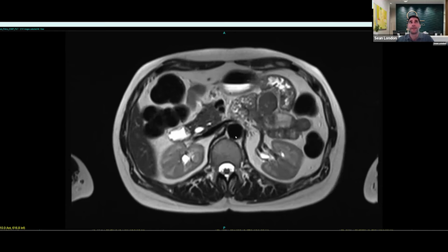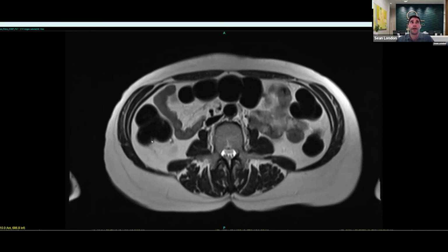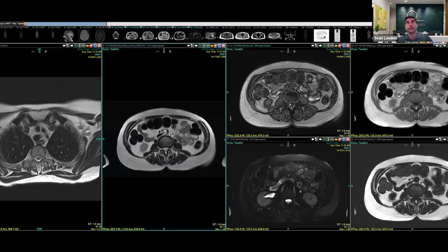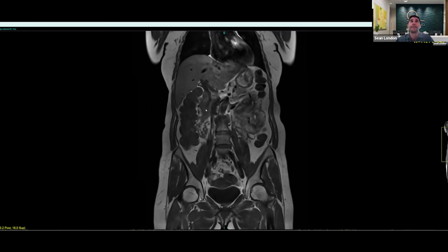The next thing I do is I look at the bowel, so the colon. That's right over here, this black area, and it actually goes all the way up, all the way across the abdomen and down. And I can show you on a different image set if I go over here. But one thing I would definitely emphasize to anybody who's going through this exam is that this is really not designed to assess the colon. We can't see polyps, and that's really what we want to be catching. The best way to detect that is scope, so a colonoscopy, and they can go in with the camera.